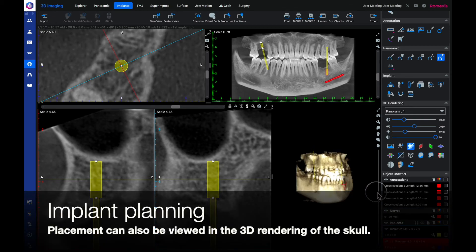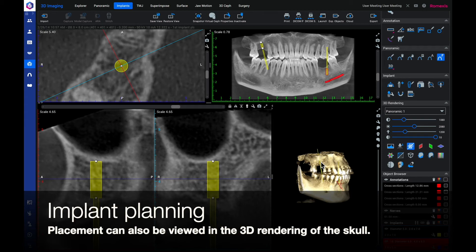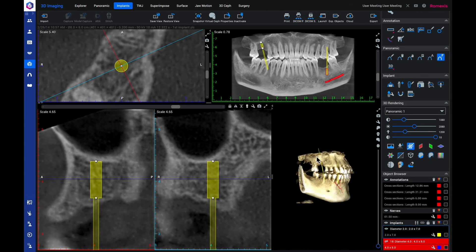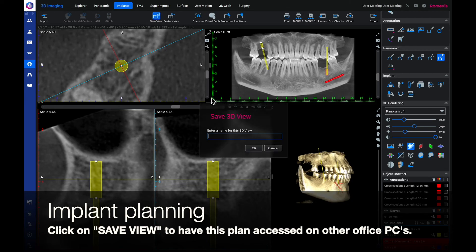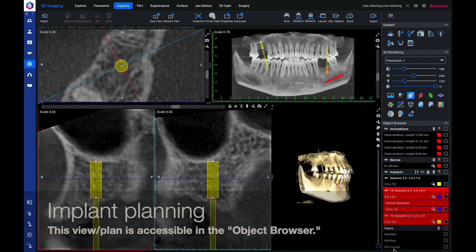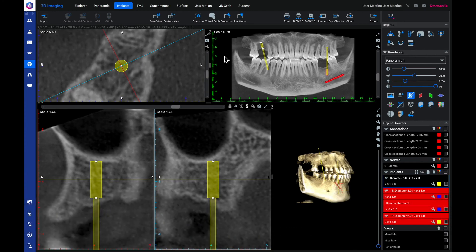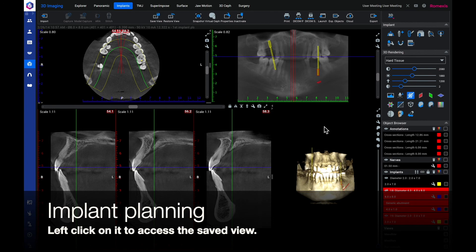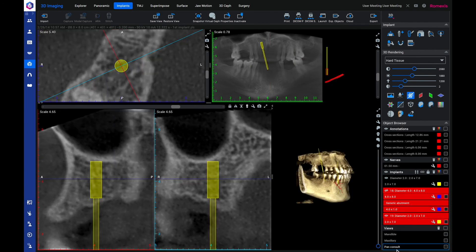Placement can also be viewed in the 3D rendering of the skull. Click on the save view button to have the plan accessed from other office PCs. This view and plan is accessible in the object browser. Left click on it to access the saved view.